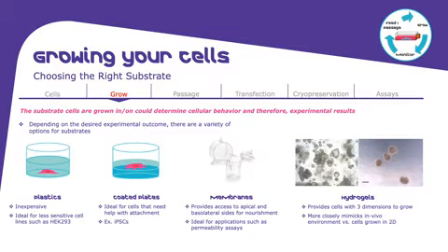There is also the possibility of growing the cells in three dimensions, and this is something we talk about in our other presentation. So if you are interested, look at our 3D cell culture presentation. In that case, it more closely mimics the in vivo environment compared to 2D cell culture. And we do have a number of different hydrogels which can help you to achieve that level of growth.